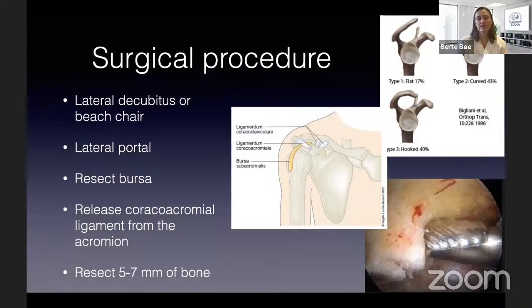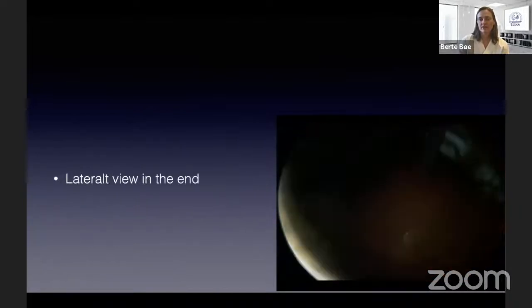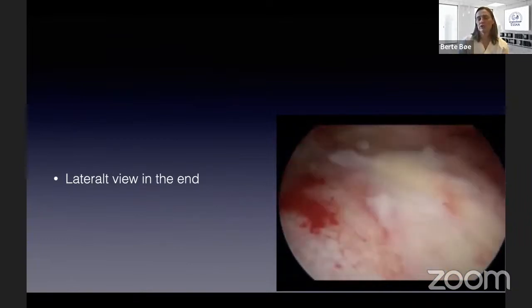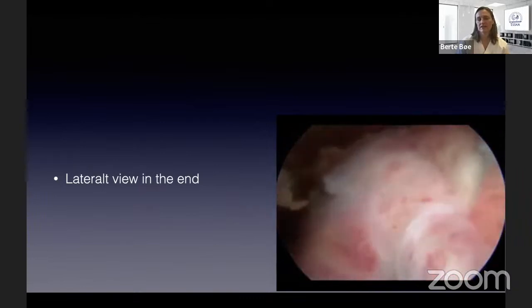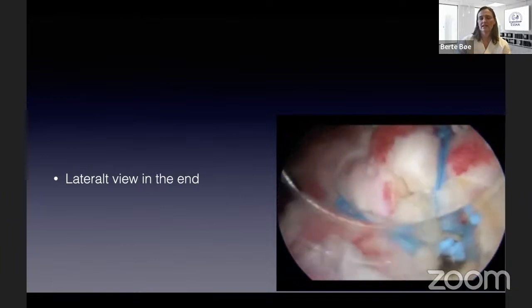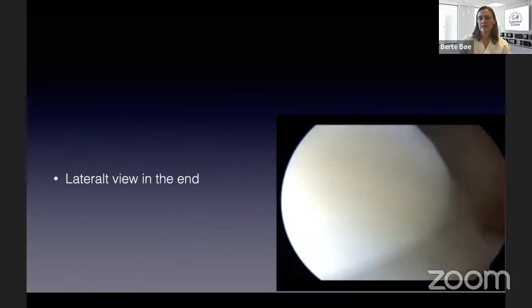And after a cuff repair, you have already resected the bursa. But in subacromial decompression, of course, you have to resect the bursa so you can see the edge of the acromion. Then release the coracoacromial ligament and resect between 5 and 7 millimeters of bone with the bone shaver. So when you have ended the procedure, either you do just suture or you also do a subacromial decompression. Again, I always put my camera lateral to see the repair. So I at least see it from two different directions. That's also very smart for the learning in the beginning.